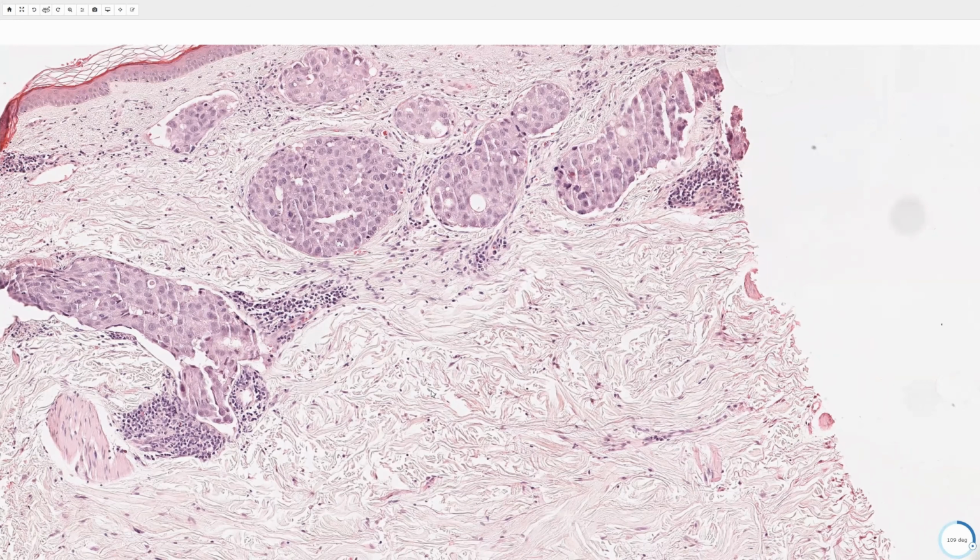And then if the patient had no history of a primary carcinoma or adenocarcinoma, you could also add a CK7 and CK20 to your cocktail. In general, CK7 will be positive for tumors above the diaphragm, where CK20 tends to be positive for tumors below the diaphragm. There are some exceptions to that rule though.